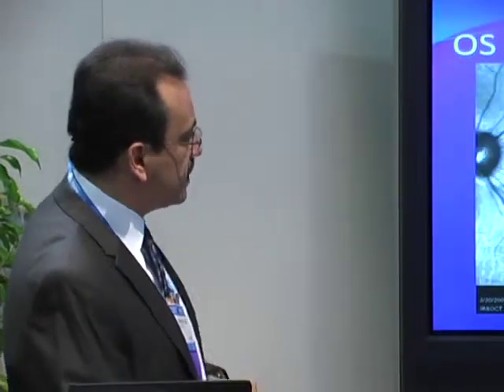longitudinally. Again, the OCT provides me with a fantastic anatomical view of what's happening with the tissue, but again, it doesn't give me an indication of what the functional status of the eye, of the retina is in these individuals.